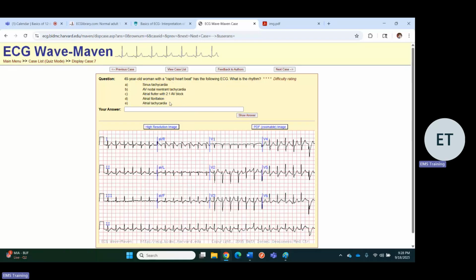Let's rule in and out stuff. But, I mean, this was one of my original guesses, so we'll keep that on the table for sure. AFib looks slightly too regular for that, and also AFib doesn't really explain why there are subtle changes, but it does look fibby here. AV nodal reentrant tachycardia, depending on where it's re-entering from and how big that re-entry circuit is, that could cause some variances. Yep.